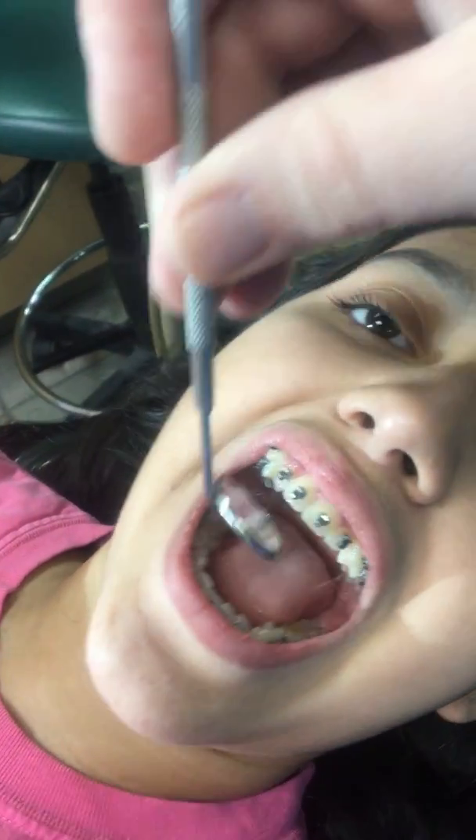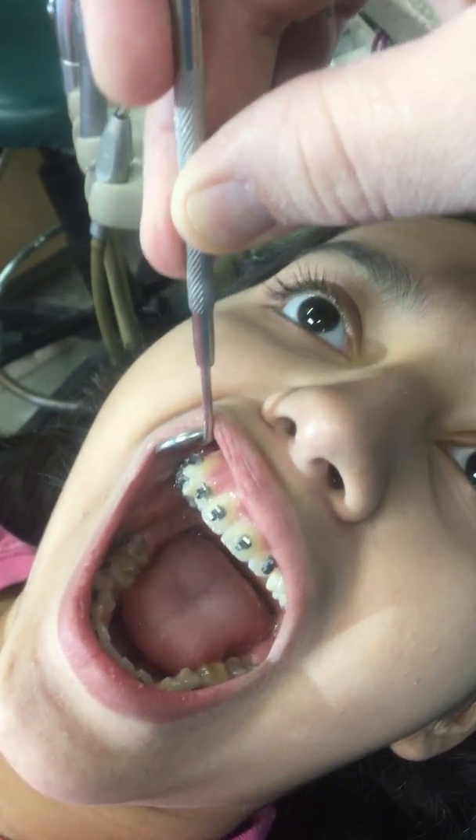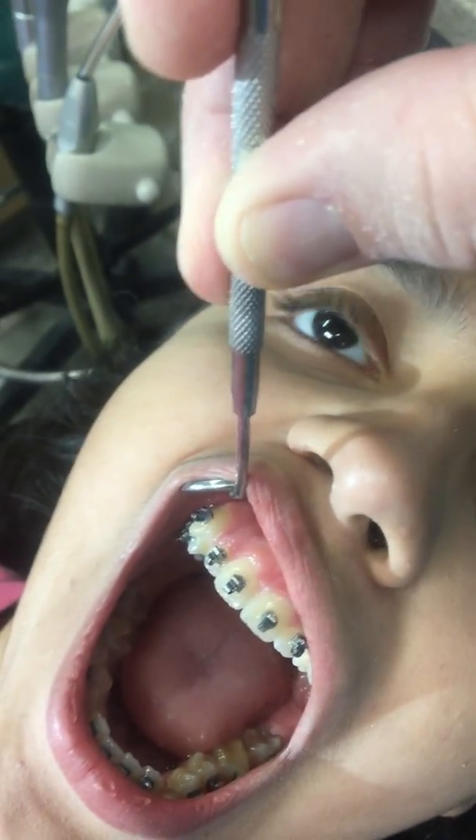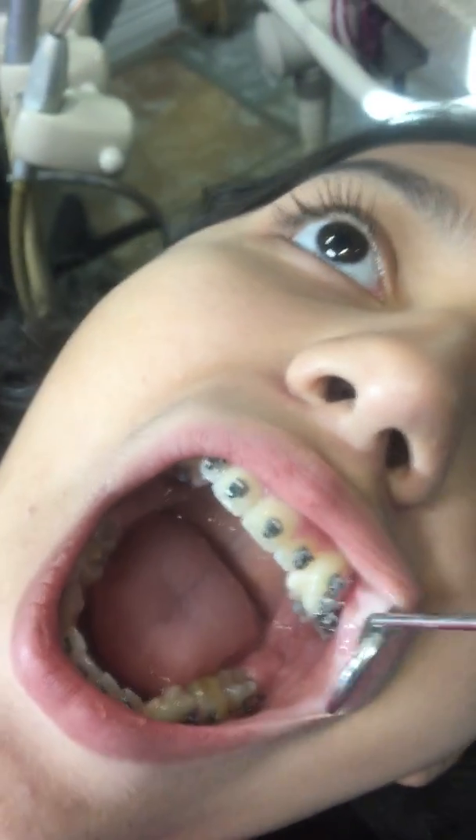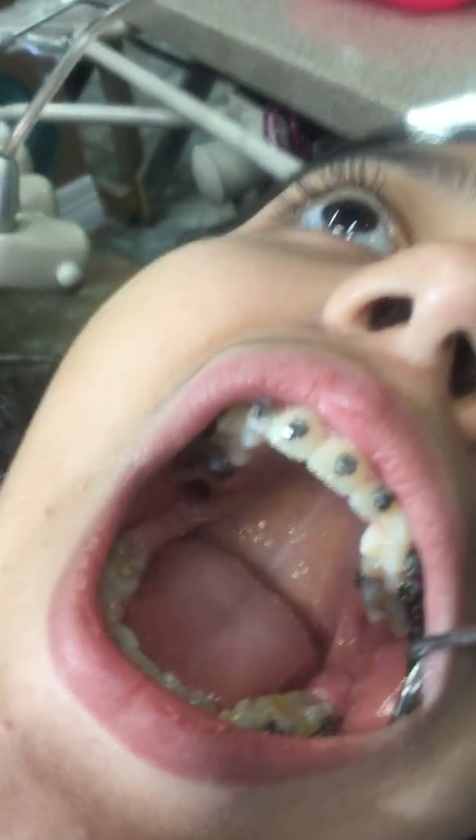This sweet young lady has some pretty severe crowding, and you can see how her eye teeth are kind of sticking out. So she needed these braces pretty bad. Plus her palate is really crowded.